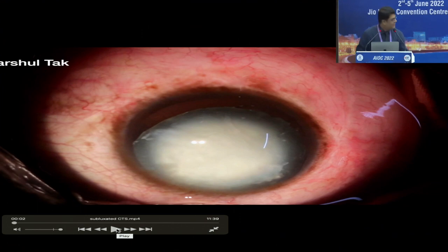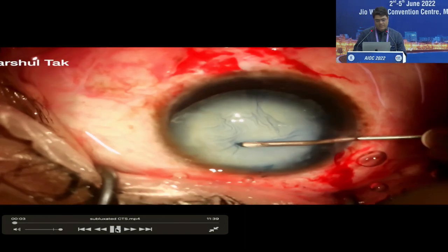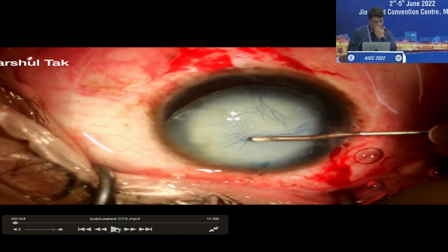So I'll be sharing one or two videos with you. This is the first video. This was a traumatic subluxation. You can see that the subluxation is more than 4 or 5 clock hours here. And this was a white cataract with a fibrotic anterior capsule. So Dr. Rohit, what is your plan of action in a case like this?